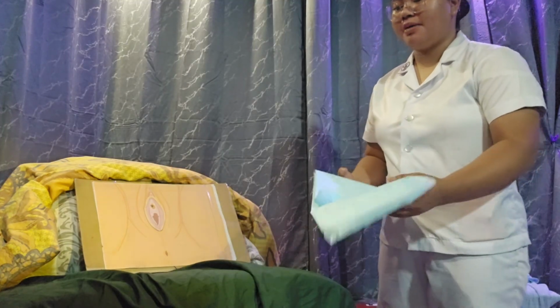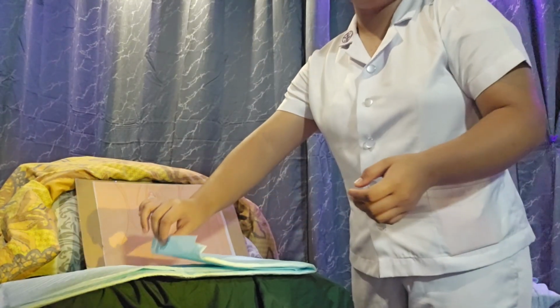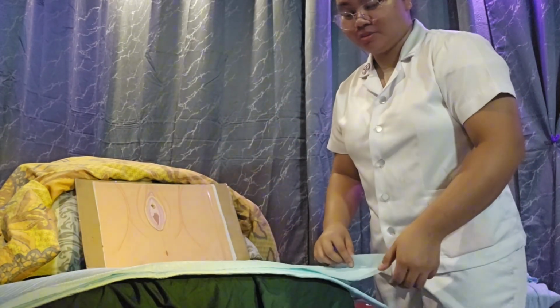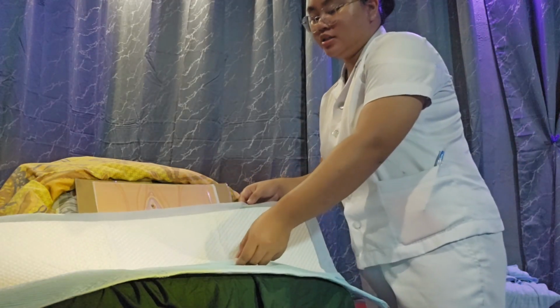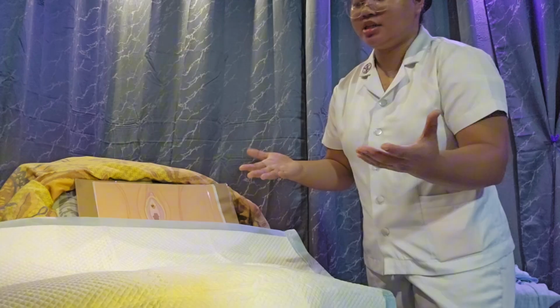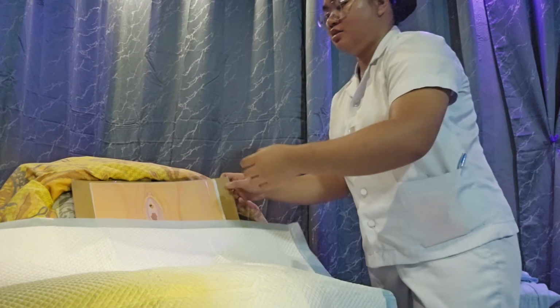So now I'm going to first put this pad po on your buttocks. So it also ensures that we do not touch any part of the central area of the drape. So this is to maintain the sterility, since our hands are not yet in sterile gloves.